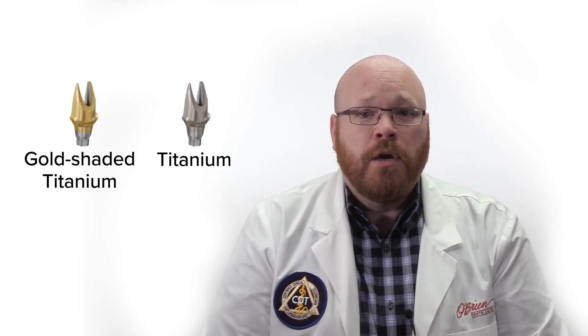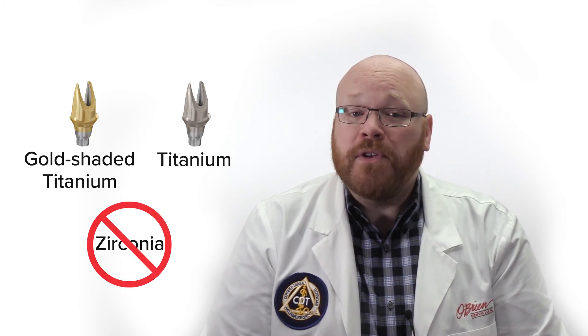It's also worth pointing out that these abutments are only available in titanium and gold shaded titanium. Currently, there's no word on whether zirconia will be available in the future.